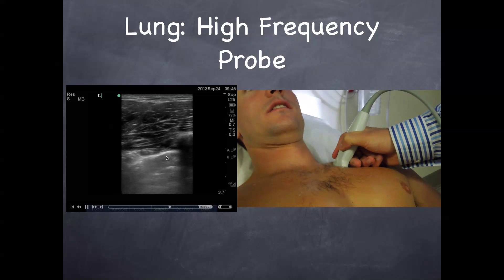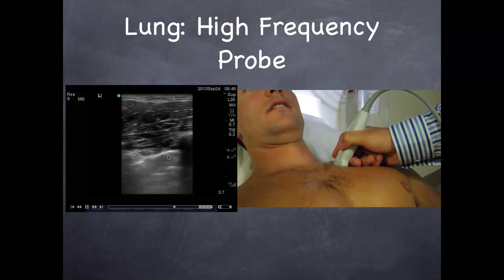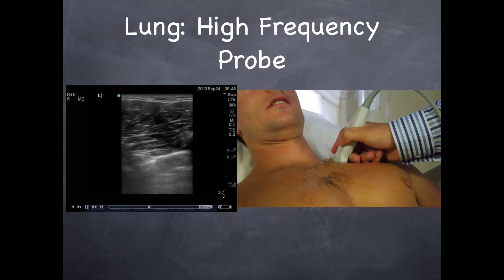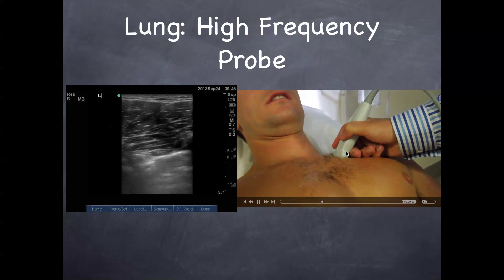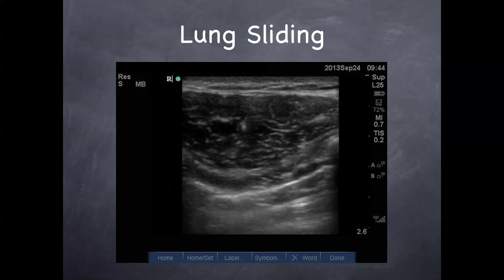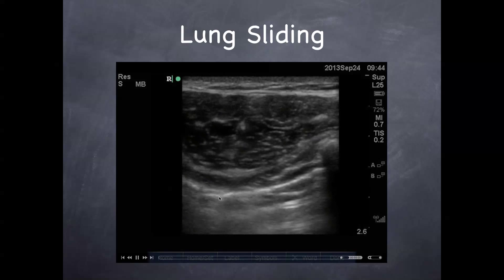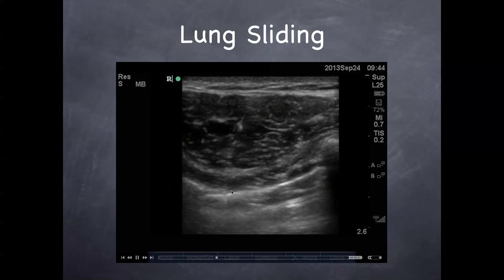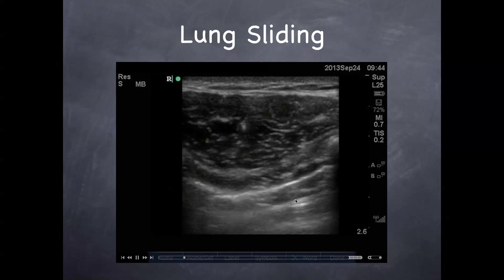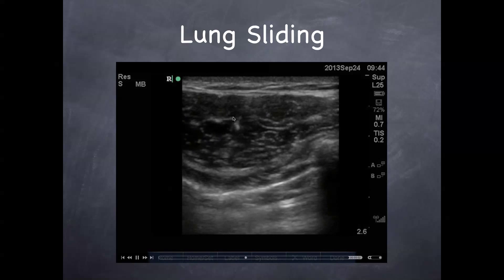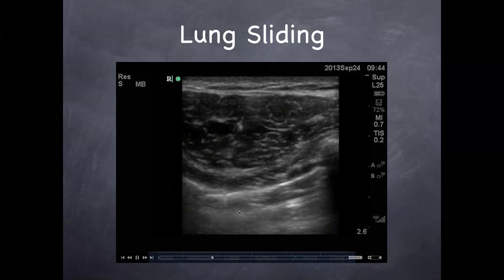With the next patient, try changing the gain up and down to get a good view. As you can see, we're really shallow at 3.7 centimeters, and we're using the vascular high-frequency probe. Here's lung sliding again — the bat sign, ribs on each side with sliding. And here are some little comet tails. These aren't B-lines, these are just comet tails, and these are normal artifacts. Soft tissue here, pleural line here. Parietal pleura, visceral pleura, lung sliding — normal.